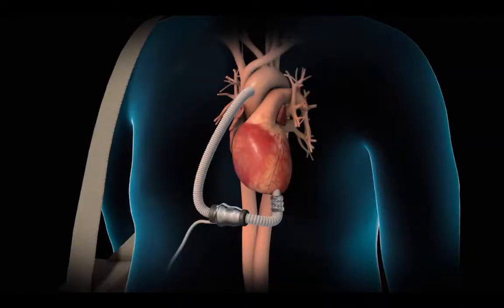A left ventricular assist device, or LVAD, was developed in the 1960s as a bridge to heart transplant. Over the years, they have evolved into a permanent solution to heart failure, also known as destination therapy. Recipients of LVADs typically have New York Heart Association Class 4 heart failure and an ejection fraction of less than 25%. LVADs are the most common assist devices, but right ventricular assist and biventricular assist devices do exist. The goals of all assist devices are to augment cardiac output.